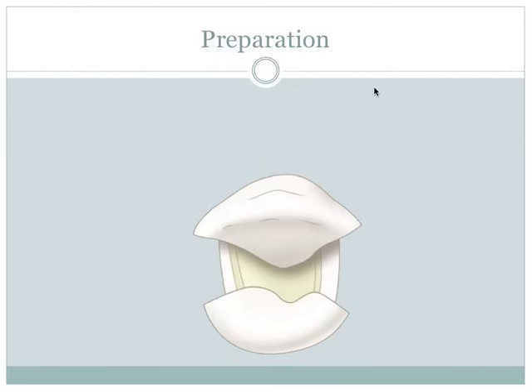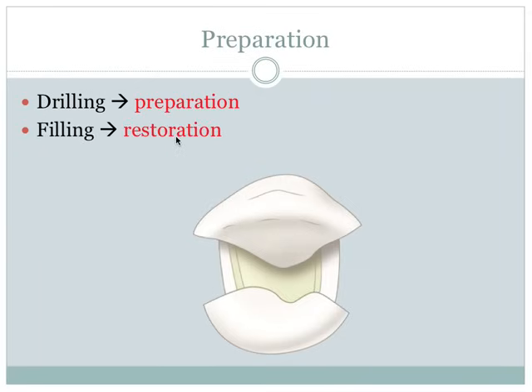So preparation is, and we can talk more about this in another video, but the word preparation refers to what is colloquially known as drilling, where you use instruments to cut out decayed tooth structure, and not only that, but design it in such a way that it doesn't only remove all the bad stuff, but leaves adequate good stuff that you can fill or restore. That's the more dental terminology used. You can restore that tooth material that you removed.